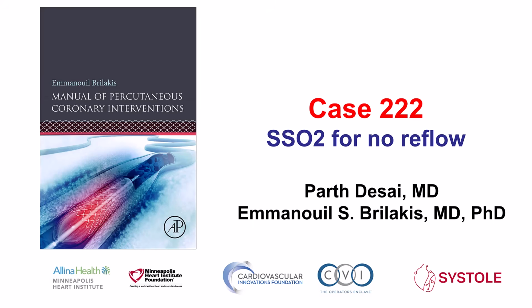This is a case of something not commonly used in the cath labs, but has potential for improving outcomes in patients with myocardial infarction, specifically SSO2 or supersaturated oxygen.